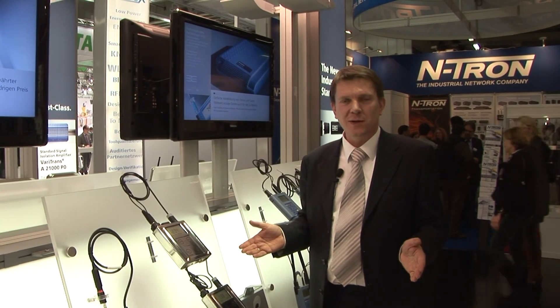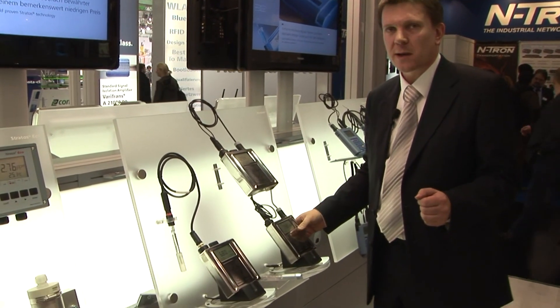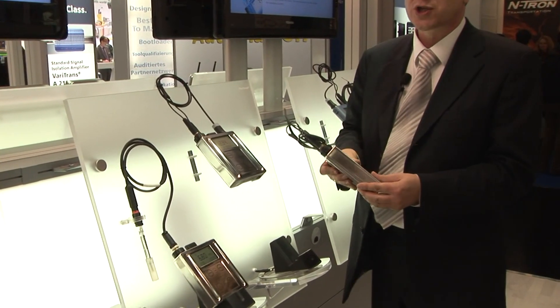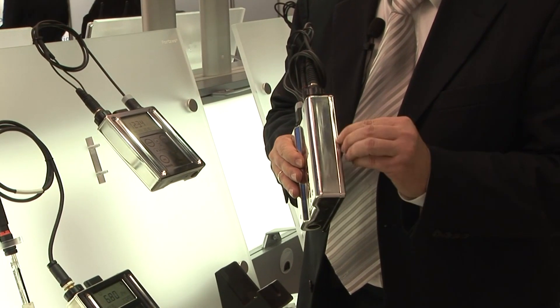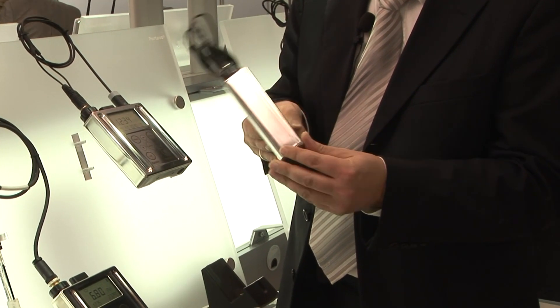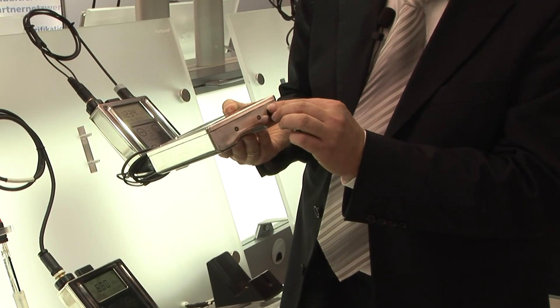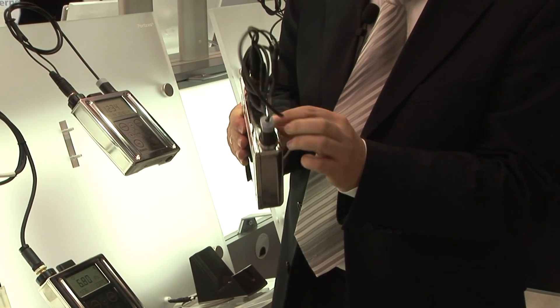Another highlight I want to present today is our new Portavo S. It's a complete stainless steel housing, which is unique in the world. We have a laser beam welded connection of the two housing parts, so that there is a completely tight housing.